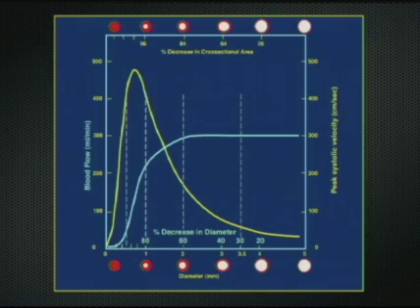If you look along the bottom of the graph, you'll see a series of images which represent a vessel which goes from a diameter of 5 millimeters on the right to completely occluded on the left. This same series of images is shown at the top of the image, but here we're depicting changes in cross-sectional area rather than diameter.